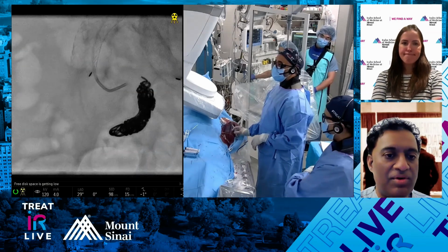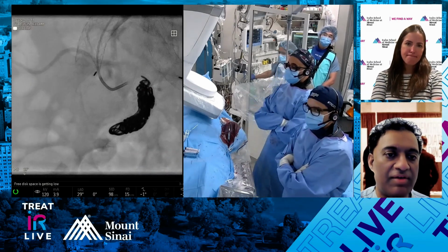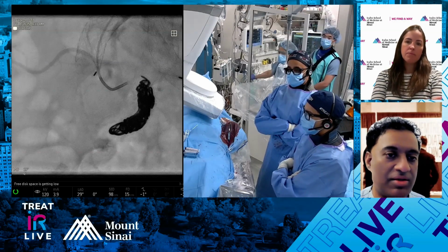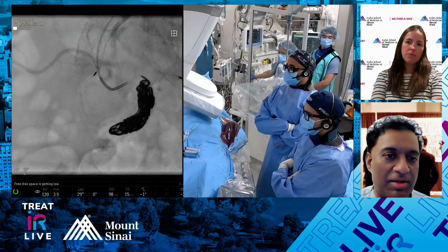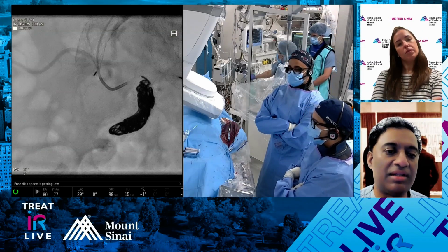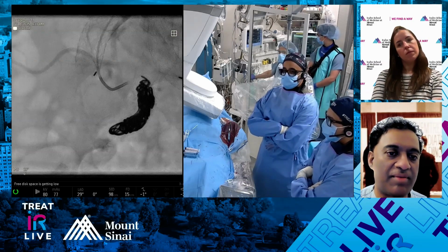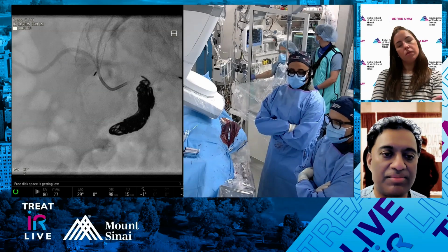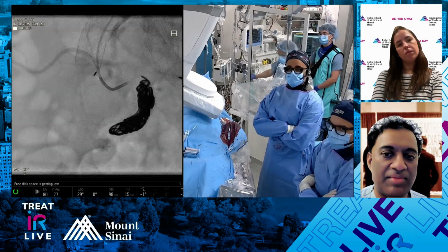I think if you're not planning on putting the covered stent in, I would be more cautious of going too distal. So one other thing you can do, say you really want to, is maintain this. You put your ipsilateral limb, your 12 French transfemoral, you deploy that, and you can finish coiling up ad nauseam, right? So that's another technique I sometimes employ.